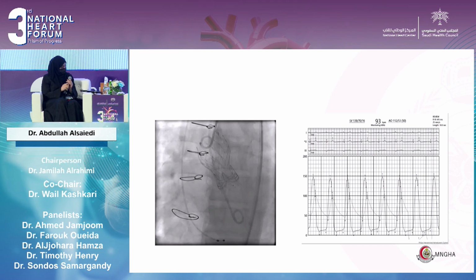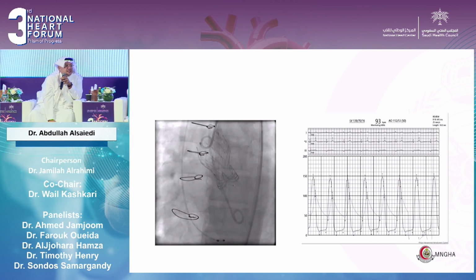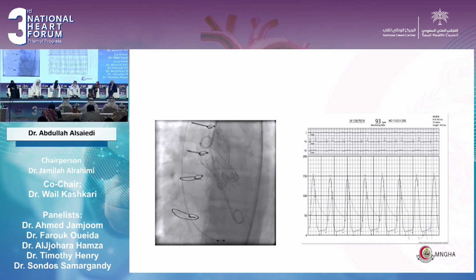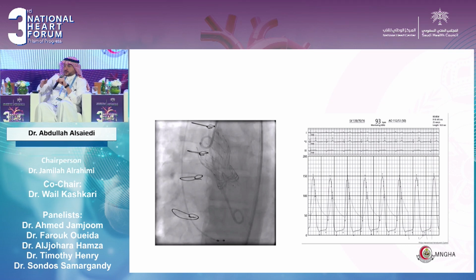Redo is going to be, for the surgeon in the nearest future, something that you will commonly see. Assalamu alaikum. Just a couple of quick comments. For sure, the trend of putting in a tissue valve is growing. To be honest, rarely nowadays do we put in a mechanical valve, knowing that you guys are going to be capable in mitral and aortic to do a valve-in-valve.